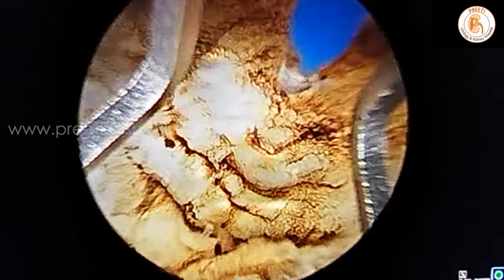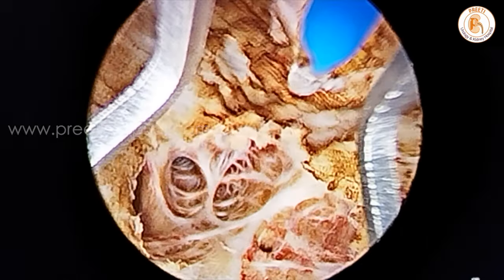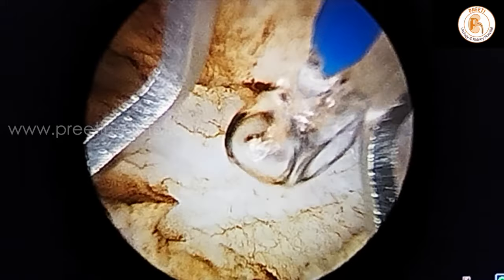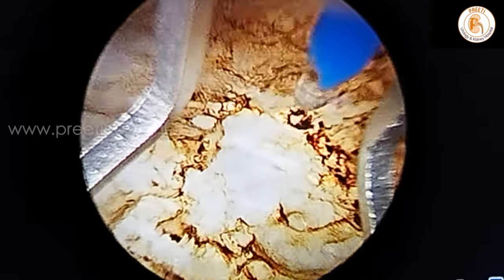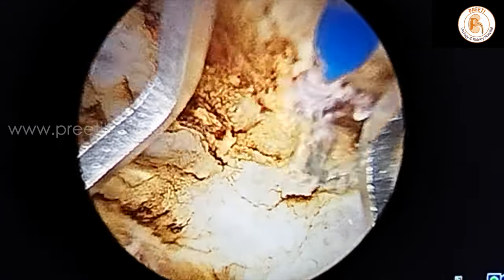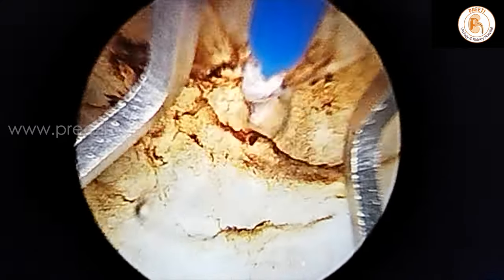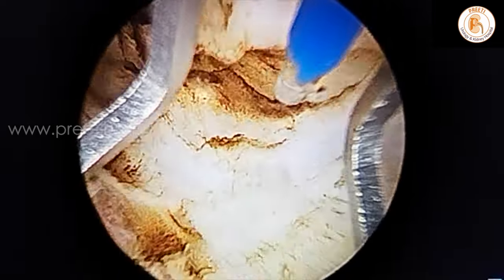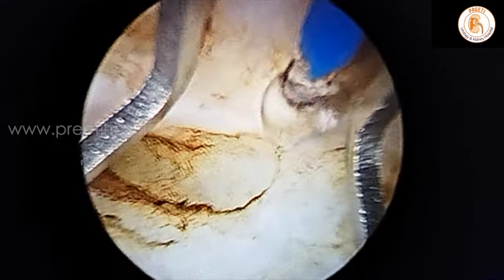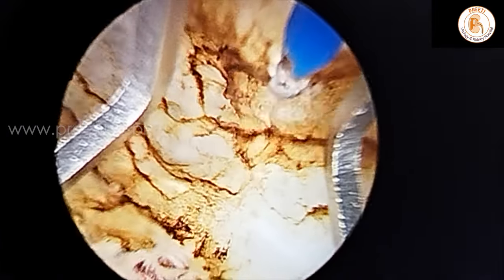This is a median lobe I am doing — it has gone quite deep while giving the incision itself. So we should be careful not to continue that, and instead go with the laser fiber on top. Then only you can safely change the plane. It appears a little charred, but the capsule is clearly seen here. On either side I have given the incision, and I will make this a U-shape incision.